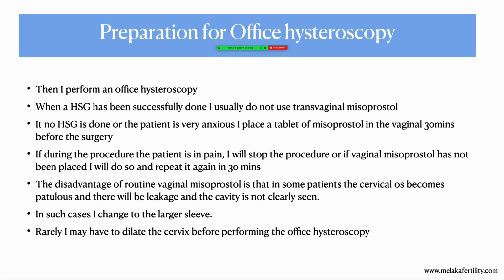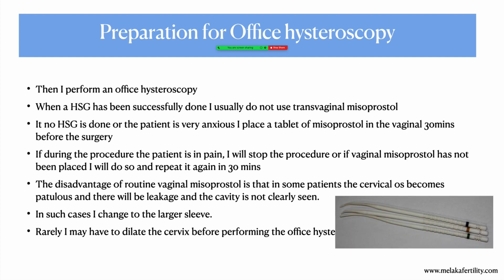Now, rarely I need to dilate the cervix before performing office hysteroscopy, and I use these plastic dilators, but this is rarely done. Most of the time it can be done without any dilatation.